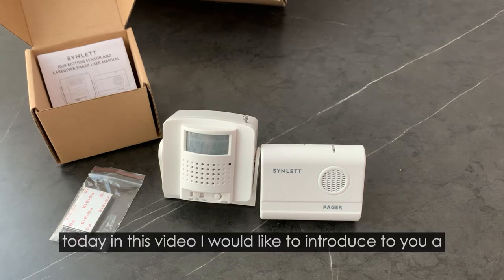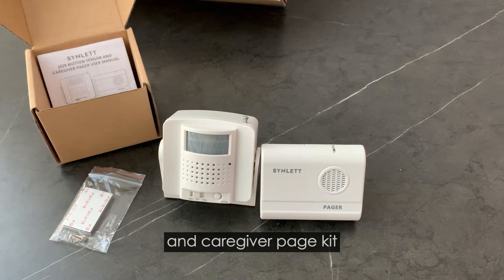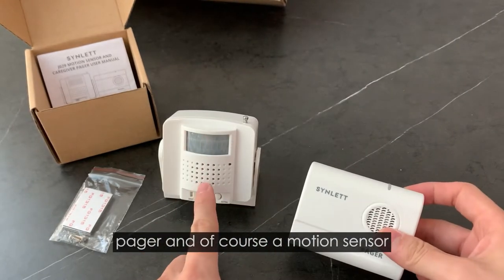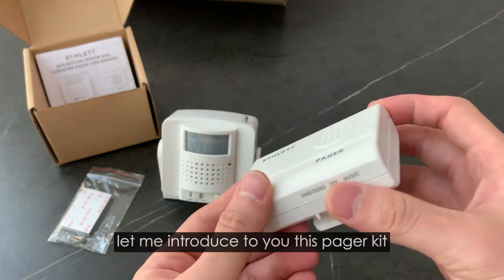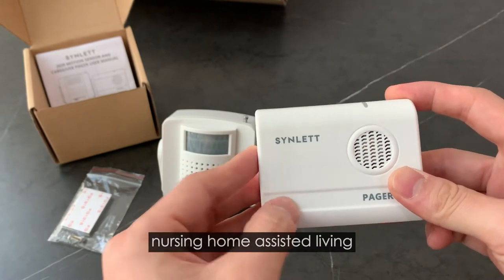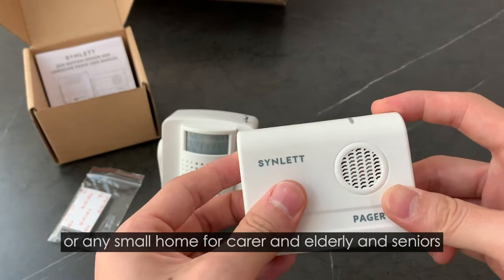Hi, today in this video I would like to introduce to you the SYNLETT motion sensor and caregiver pager kit. This Pager Kit comes with a battery-operated portable pager and of course a motion sensor. It works in various settings like nursing homes, assisted living, or any small home for carers and the elderly and seniors.